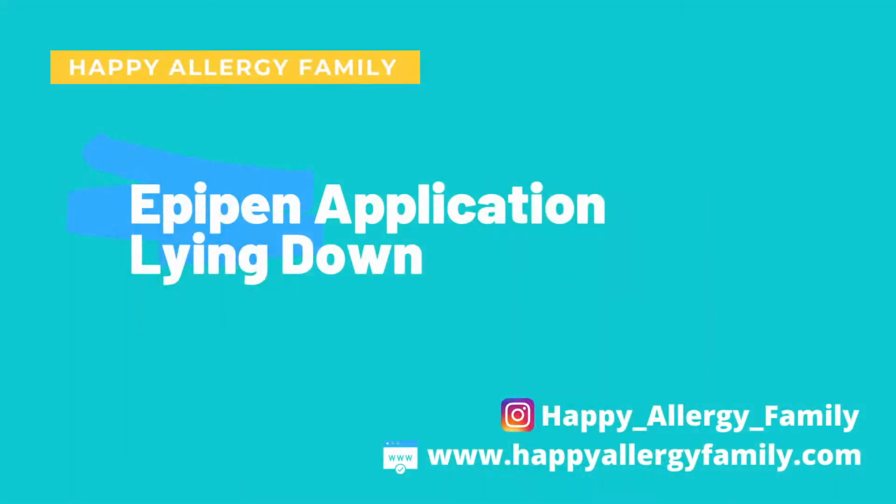You'll hear a click. And then we do a 3 count. So 1, 1,000, 2, 1,000, 3, 1,000. Once that's done, you can remove it because the medicine has been applied. And don't worry about the needle because this orange protective cover will automatically cover the needle. So we'll put this down. Don't forget to call 911 for help.